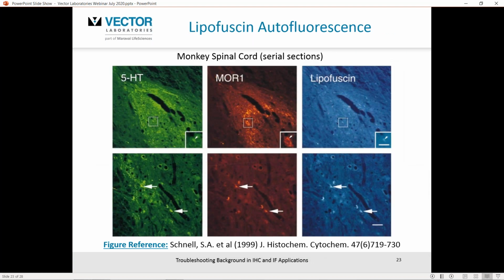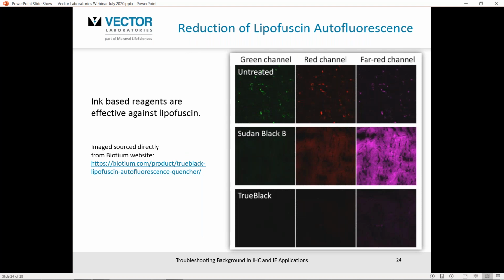One other area of autofluorescence is lipofuscin, and I've taken this image from the reference below. These particular authors did indicate that they were seeing a double false positive due to the presence of lipofuscin in their monkey spinal cord tissues. So lipofuscin is an accumulation of proteins and lipids, particularly in CNS or brain, spinal cord type tissues, in aged tissues. So if you're working on an Alzheimer's model or Parkinson's, you may encounter lipofuscin. If you do, then certainly the ink-based reagents are effective against lipofuscin.